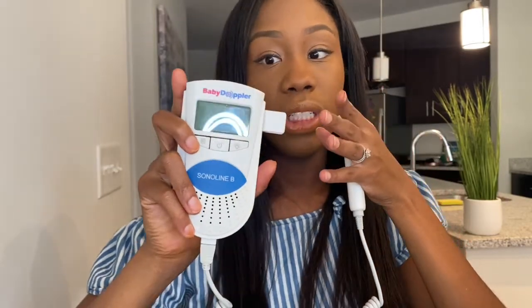The Doppler can be detached as such, and it has 3 buttons on it. It has the power button, the light button to light up the screen, and then it has the channel button. It does have 3 different channels to give you 3 different frequencies. If you think maybe you get a more accurate frequency on channel 2, 3, or 1, normally I just stick with channel 1. As well as it does have a headphone set, because this does get kind of loud with all the static and the fluid that you can hear. It does get a little loud, but I'll explain that later.